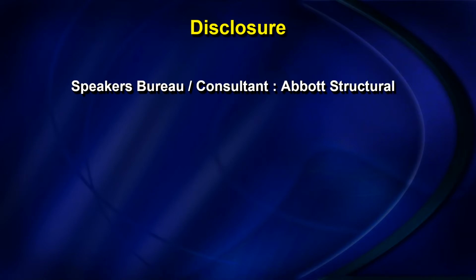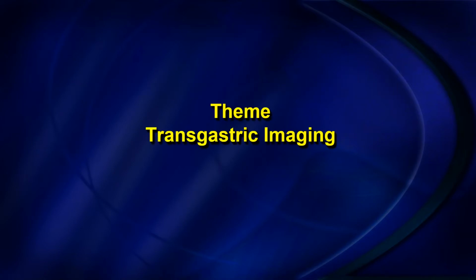Here's my disclosure slide. Since there is only so much you can do with the probe in the tube that is the esophagus, the theme of this talk will be transgastric imaging.